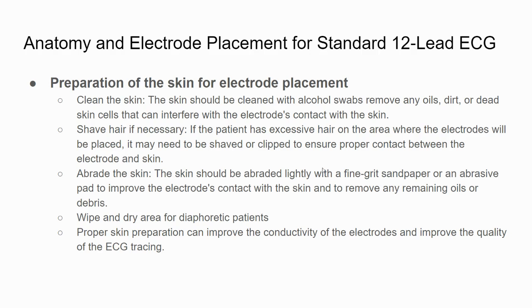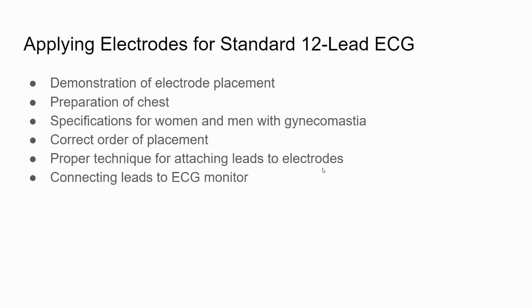So proper skin preparation can improve the conductivity of electrodes and can improve the quality of the ECG tracing. Because if we don't have a good quality ECG, it cannot be diagnostic, okay? You cannot interpret that ECG.